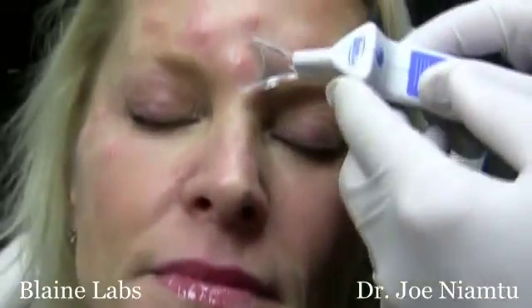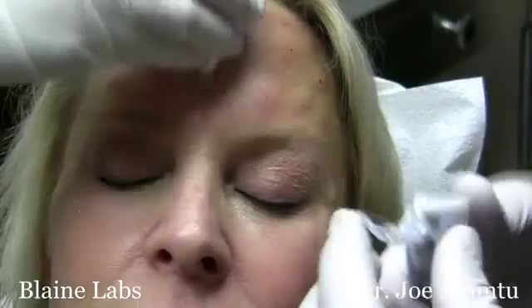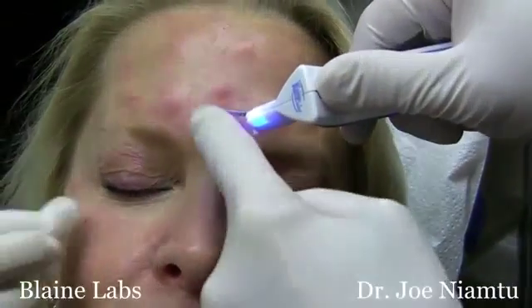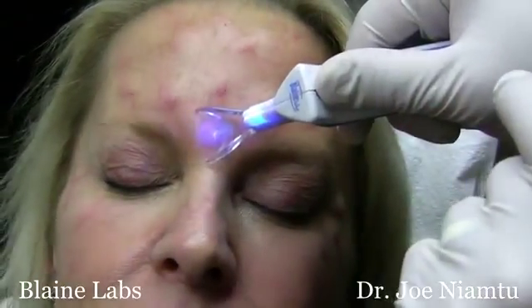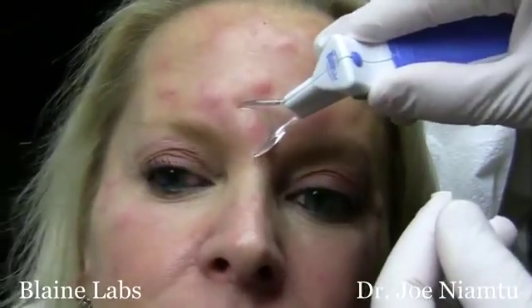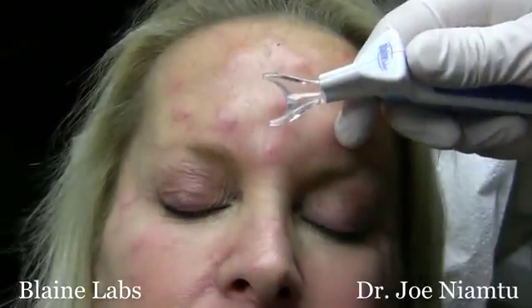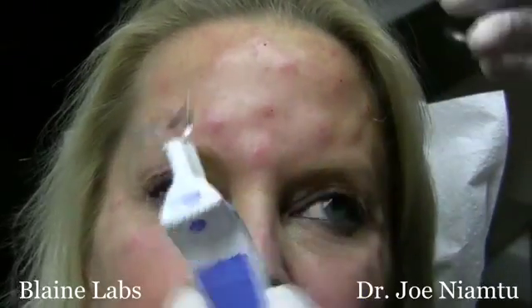The device is nice because, first of all, there's a little light that you can see, and that light kind of shows you the area of active vibration or pain control. And this little plastic piece on the front, I like that as well because I can stretch the skin or position the skin with it, and it's pretty ergonomic, and it's just set up well to use for injections. Alternately, you can have the staff do this while the surgeon does the injections, but I tend to do them both at the same time.